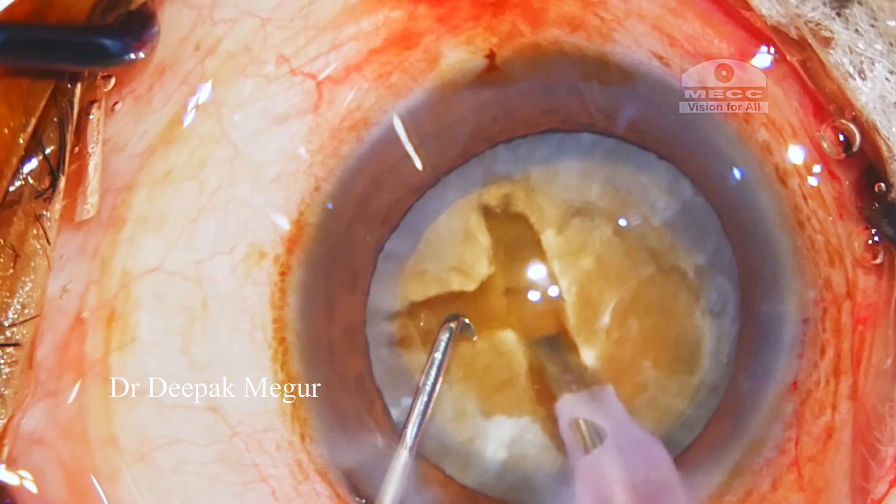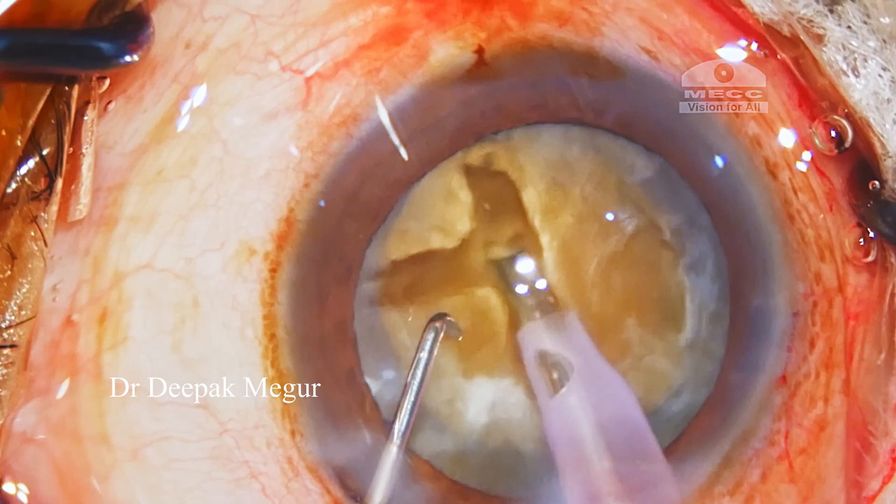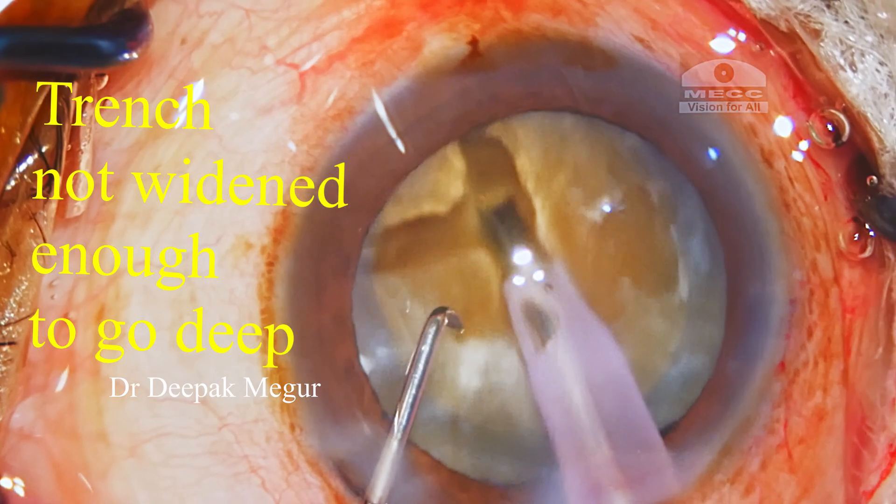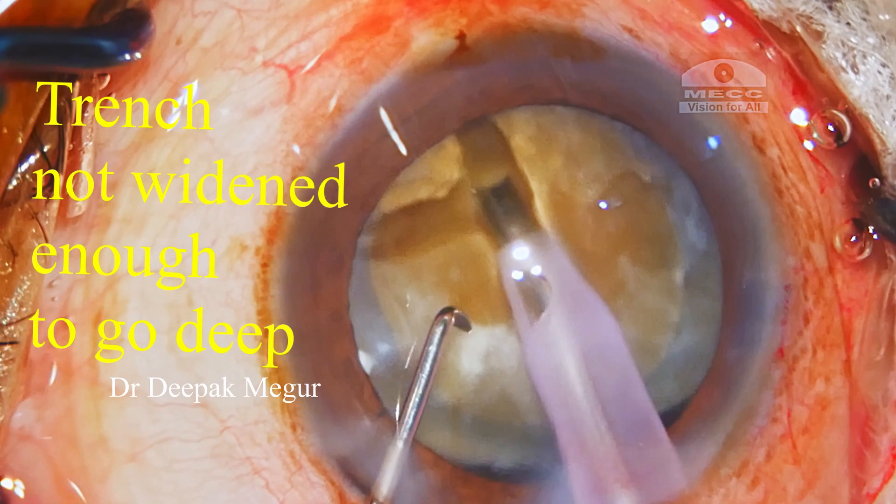Moving on, in the next trench the surgeon wants to go deeper but is unable to go deep, and instead the nucleus is being pushed again. We can clearly see that the reason for this is that the sleeve is being obstructed because of the narrow trench.